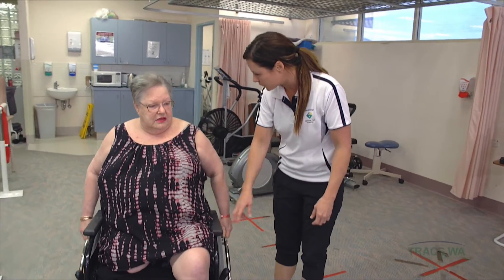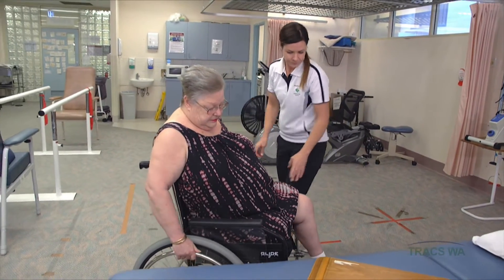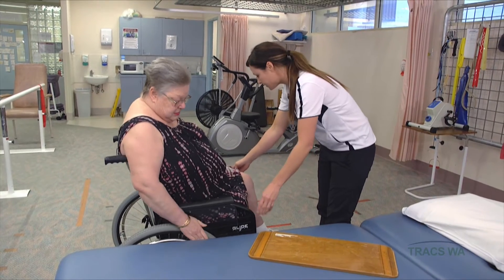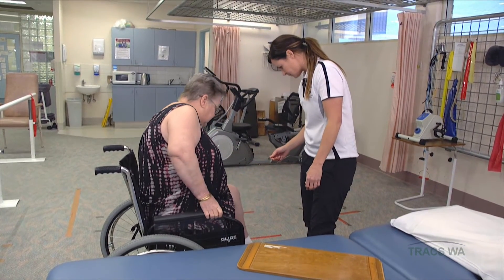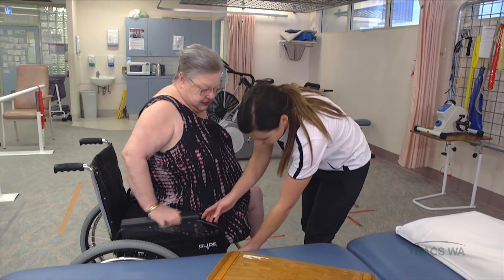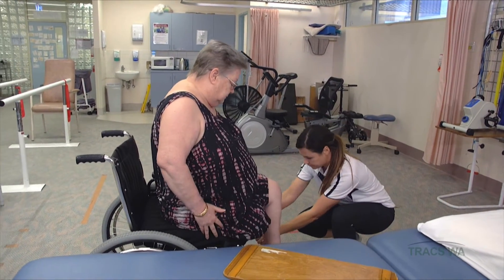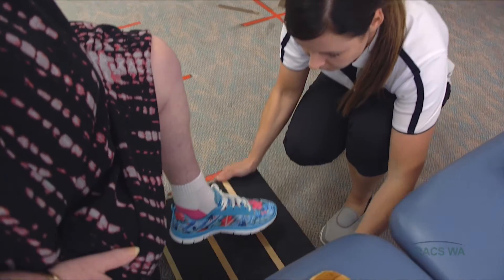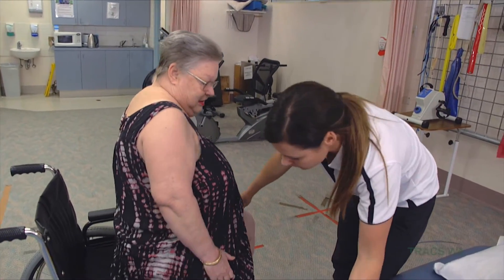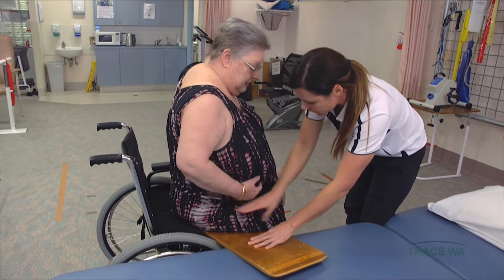We'll practise some slide board transfers onto the bed. Park yourself nice and close towards your right-hand side, then reverse a little bit. Put your brakes on and shuffle your bottom a little bit forward. We'll take this armrest off and take the footplate away. We'll use a block underneath your foot today, just because your leg doesn't reach the floor. Lean over towards your left side and we'll place this board underneath your bottom — I'm just going to press it down into the pillow — then bring that hip back down.